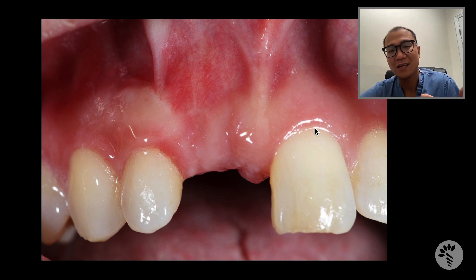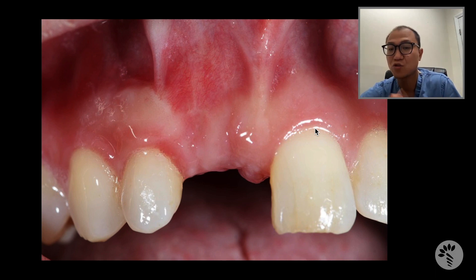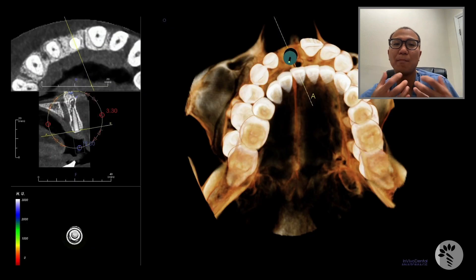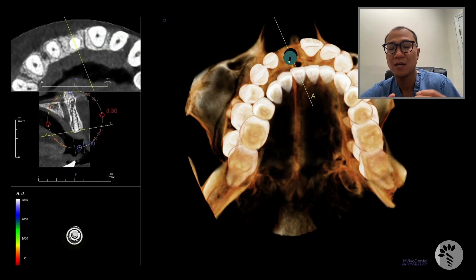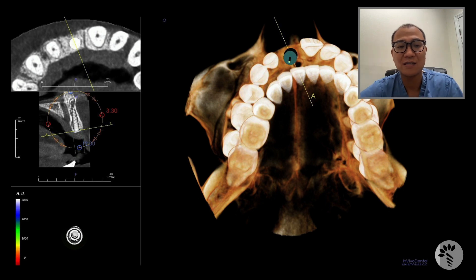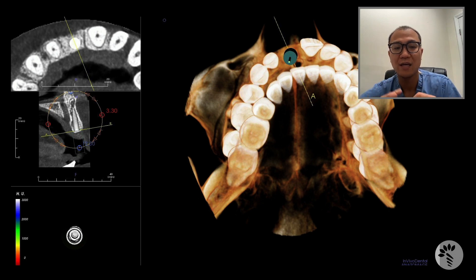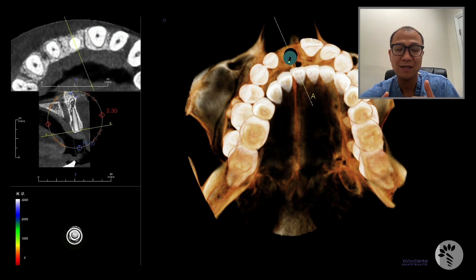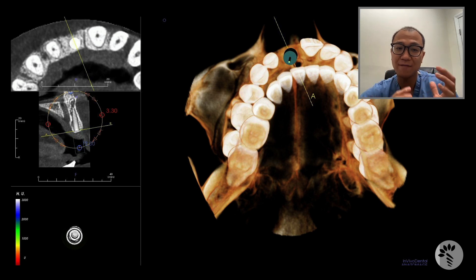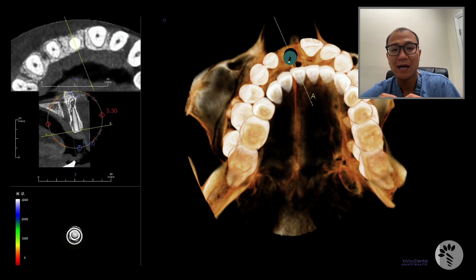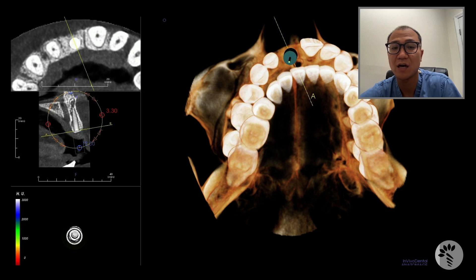Before I start the treatment, I have to think about how I'm going to make my incision. I also need to see how much bone is available, which is done by obtaining a CT scan. The CT scan allows me to plan the right size and length of implant preoperatively and simulate placement first. Based on the shape of the bone, the alveolar structure, and the underlying anatomical landmarks, I decided to place a 3.3 by 12 millimeter implant in this location.